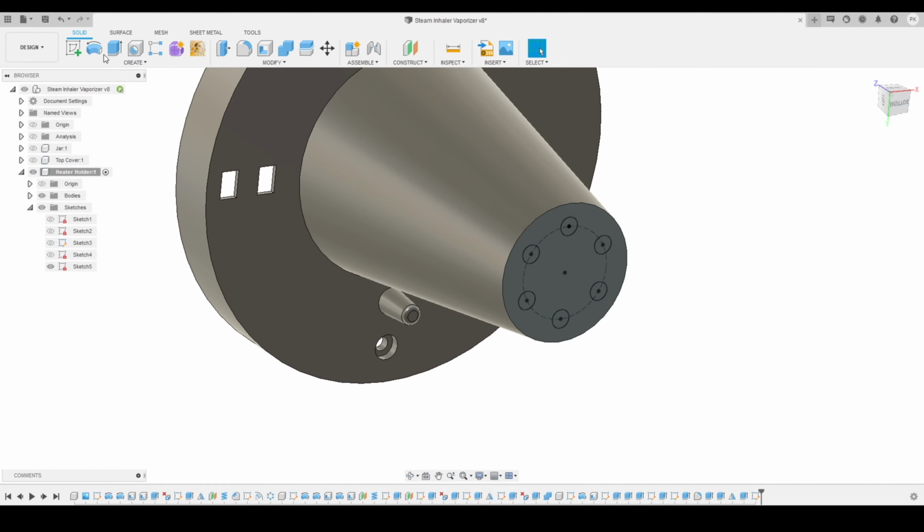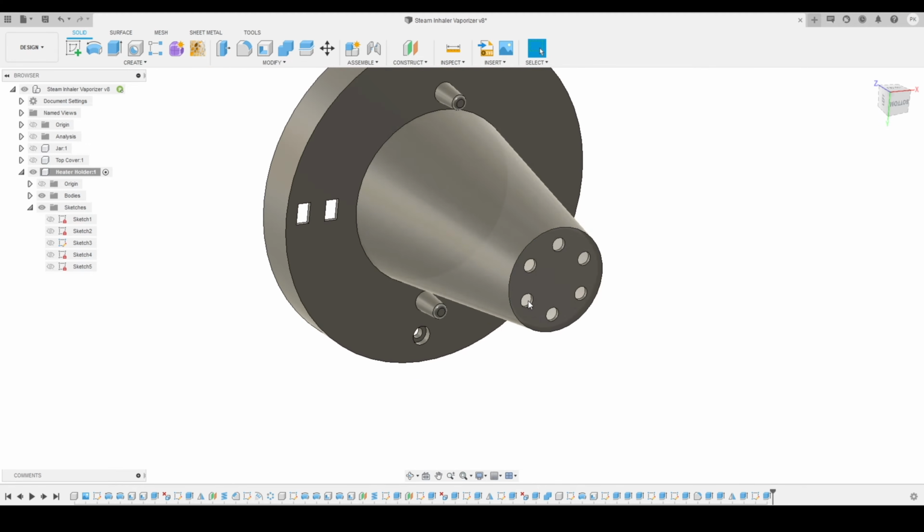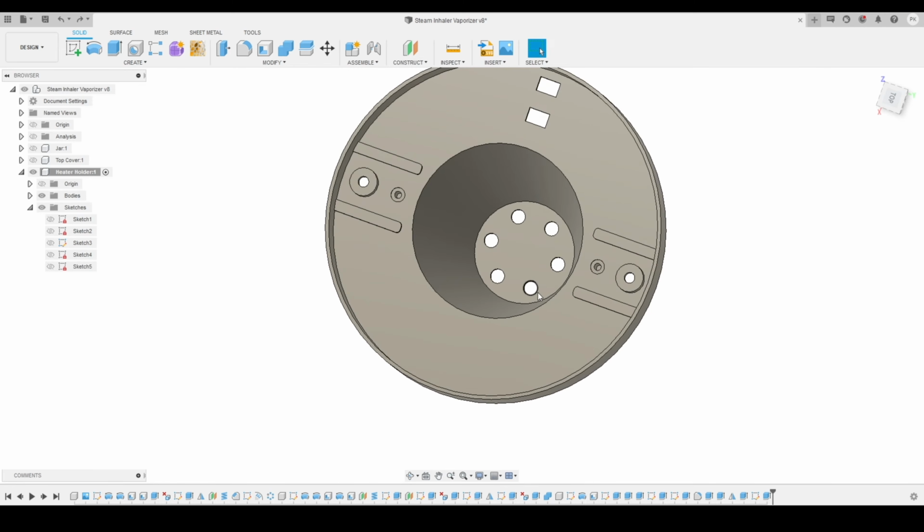Then we'll activate the extrude tool. We'll select all the profiles, 6 profiles. Here you can see all the 6 circles, and we'll extrude it towards the other side, so it will make a cut on the body. So here you can see we got holes over here.